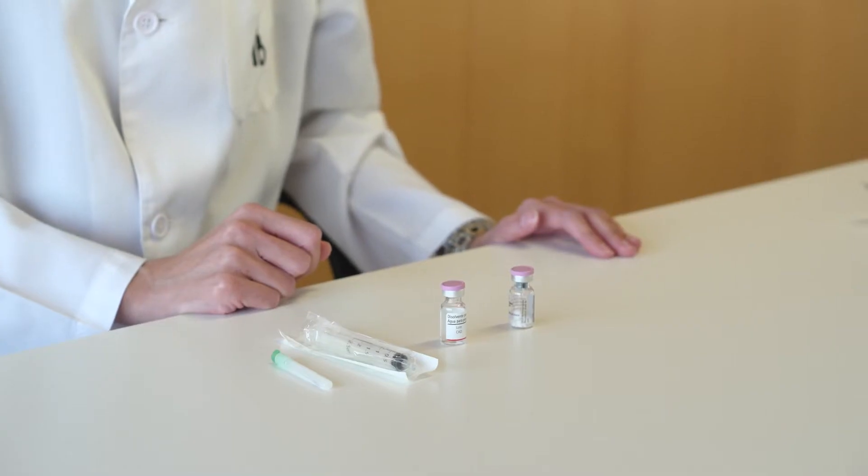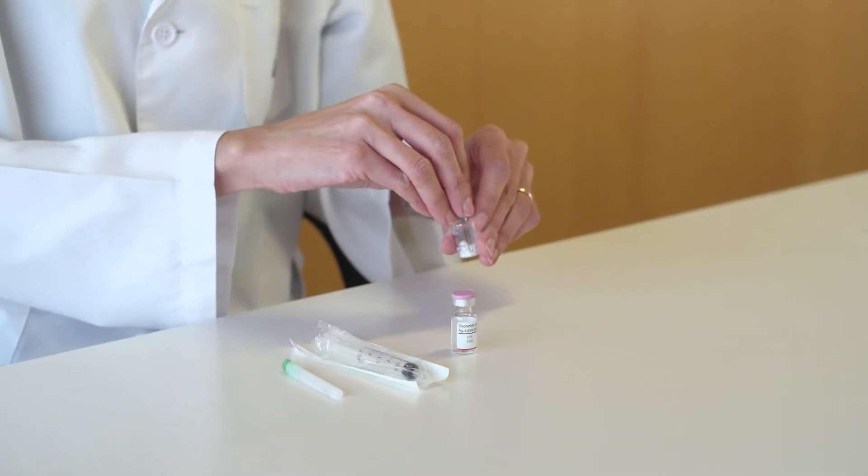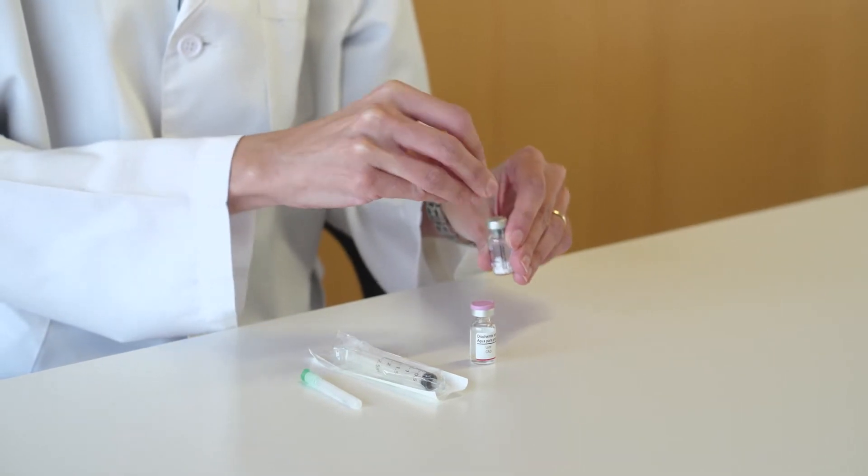To reconstitute the lyophilized vial, remove the plastic cap from the top of the lyophilized and solvent vial by gently pushing it upwards.